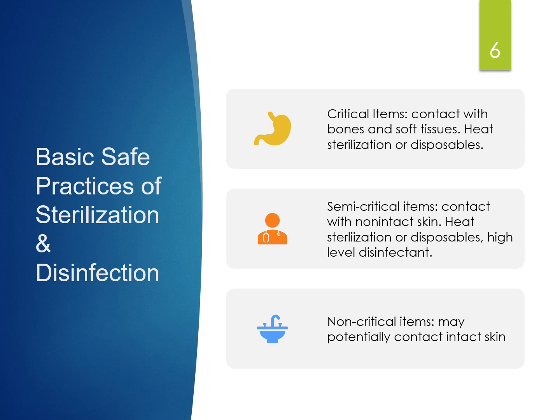These have a lower risk of transmitting diseases. However, they should also be disposable or processed with high heat sterilization. Some examples can be mouth mirrors or impression trays that we may use. And then we have the non-critical items, and these items could potentially come in contact with intact skin, and they pose the lowest risk of disease transmission.